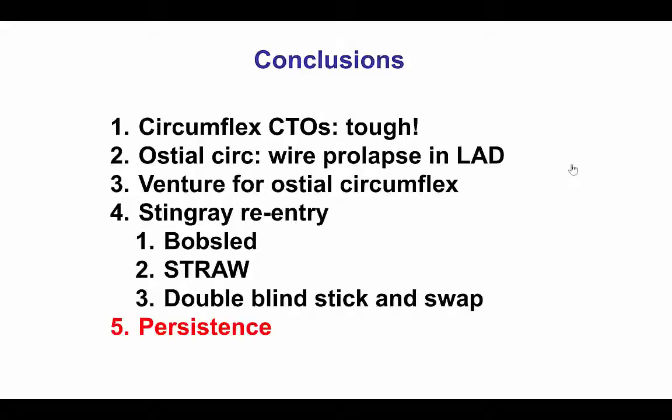The ostial circumflex can be hard to wire because the wire tends to prolapse into the LAD, and in this case the Venture catheter was very useful, providing strong support and a bend for wiring into the circumflex. We had to perform several re-entry attempts, essentially using every Stingray technique: the bobsled — trying different parts of the vessel — and the STRAW (subintimal transcatheter aspiration withdrawal), in which we aspirated from the back end of the Stingray balloon to empty any subintimal hematoma, followed by the double blind stick and swap technique to re-enter the distal vessel.